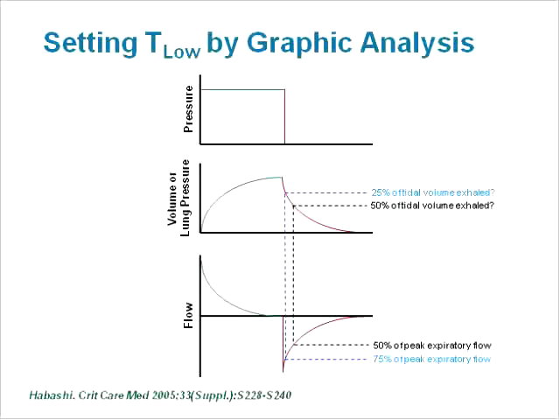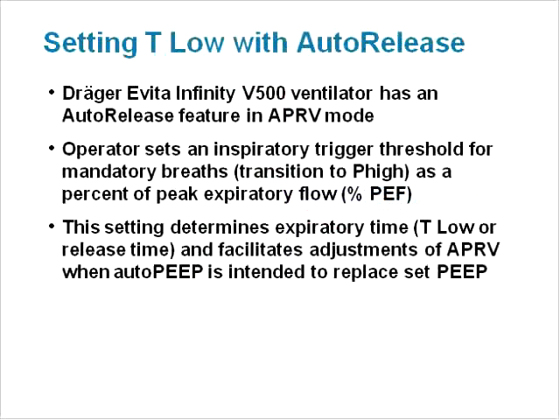Needless to say, the breath-by-breath auto-PEEP will vary, perhaps considerably, in contrast to a set PEEP value. This may not be detrimental, particularly in light of recent evidence favoring biologically variable ventilation, so long as it does not drop below the lower inflection point of the pressure-volume curve. Unfortunately, the most probable way of detecting this drop will be a loss of oxygenation.